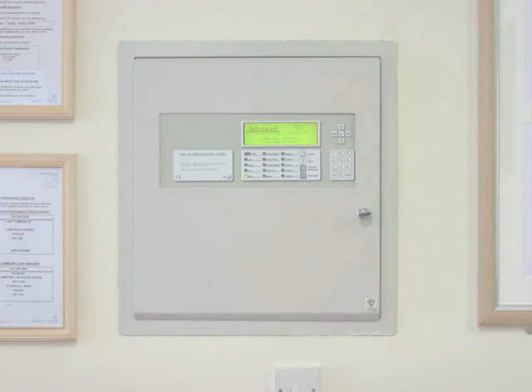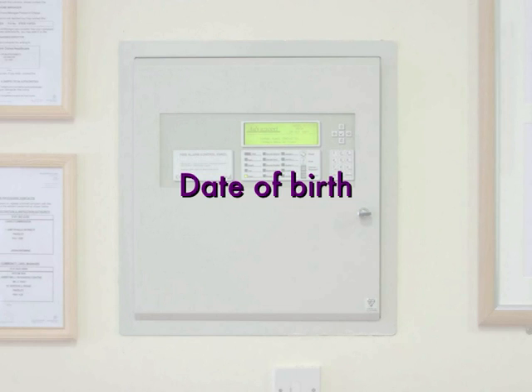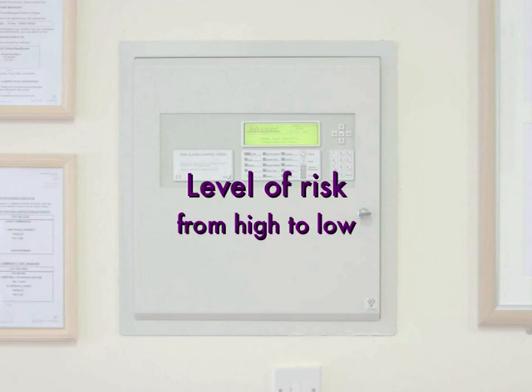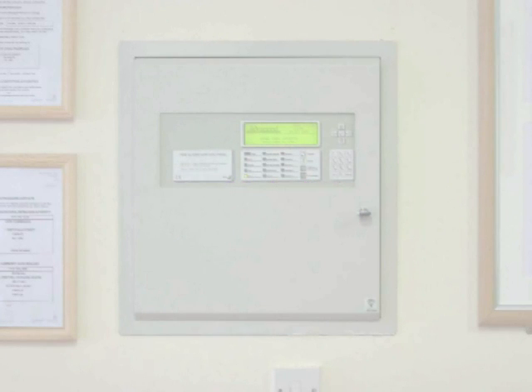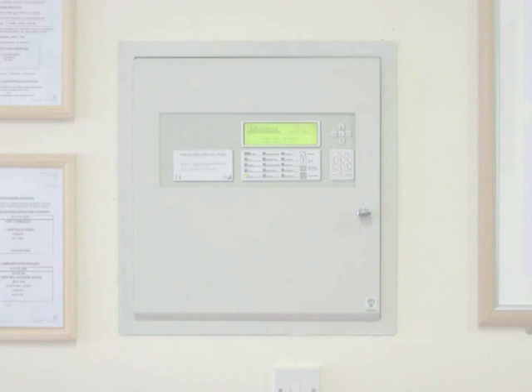These files also contain the evacuation procedure and information for the entire care centre. They provide information on the name of the service user, their date of birth, bedroom number and floor allocation, the level of risk from high to low, the location of equipment, i.e. a ski sledge on the bed, and the number of staff required to move the service user.